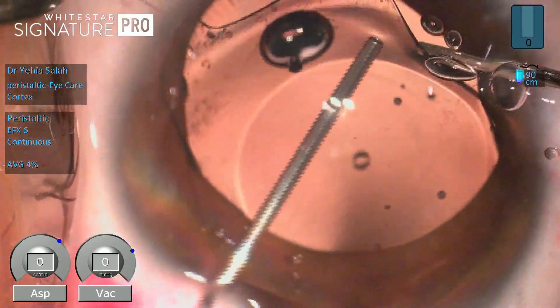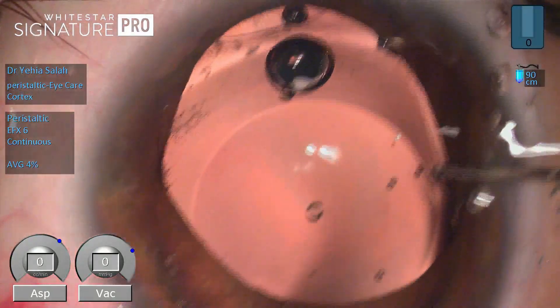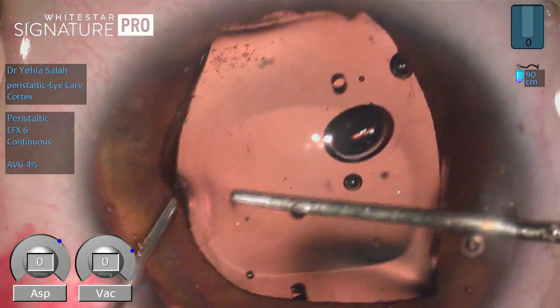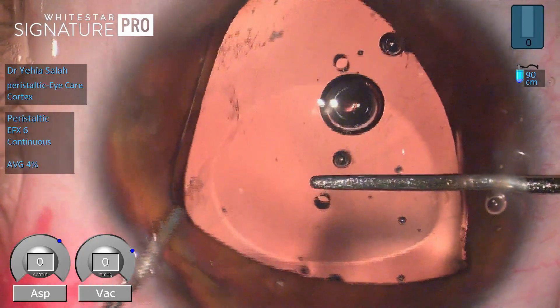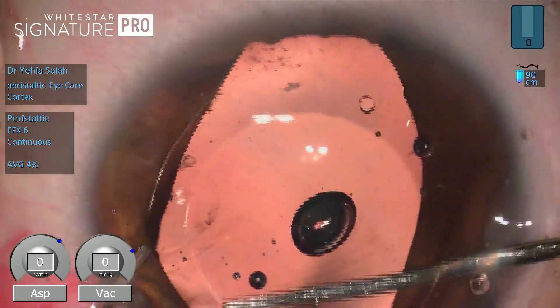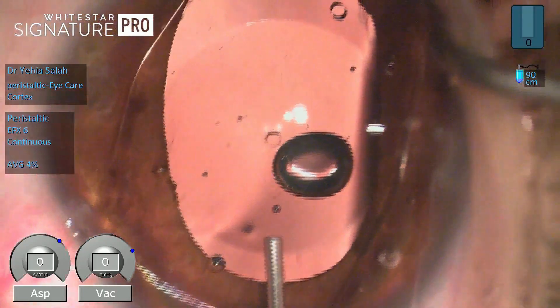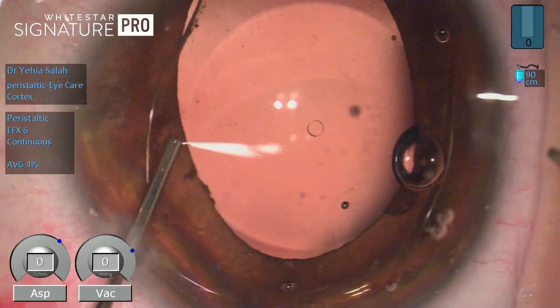Here I'm using a fine spatula and a cannula to deliver the ICL into the anterior chamber through the pupil. What makes this procedure difficult is that the pupil does not dilate more than what we see, making it a little tricky, but with patience the ICL is delivered into the anterior chamber. Viscoelastic continues to protect the anterior lens capsule and corneal endothelium while creating space in the anterior chamber.